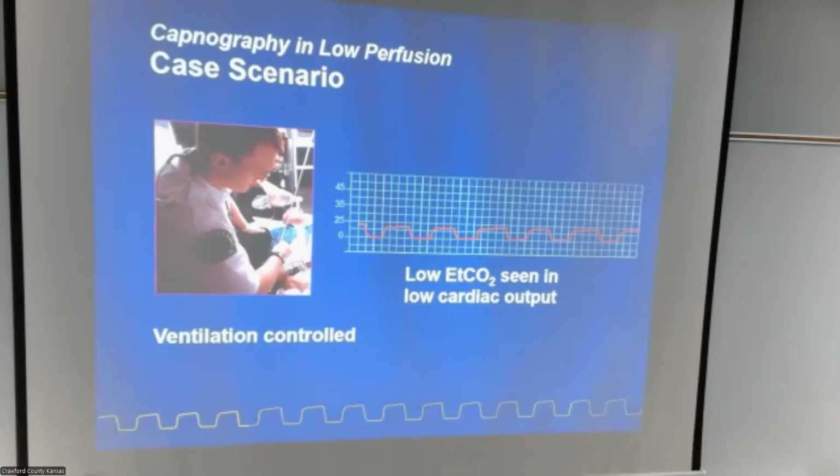What we want to do is control his rate and control his oxygen input at this point. Let's take over his respiratory drive. Let's set him where we want him to be and see what we get. It may be as simple as putting him on 40% oxygen and a breath rate of 16 to bring his end tidal back up to where he wants.